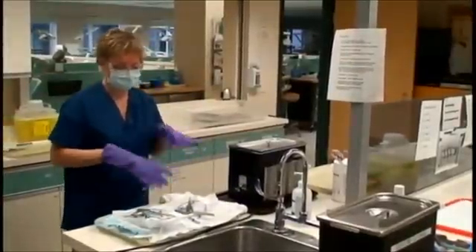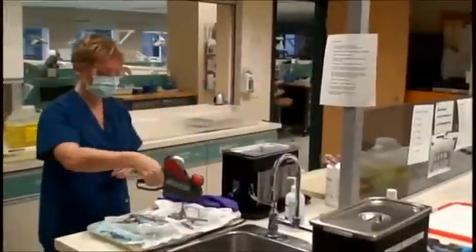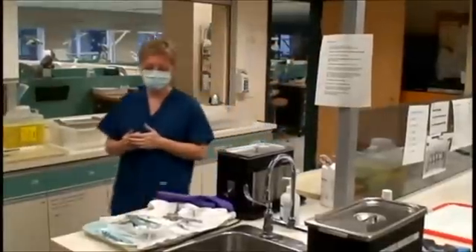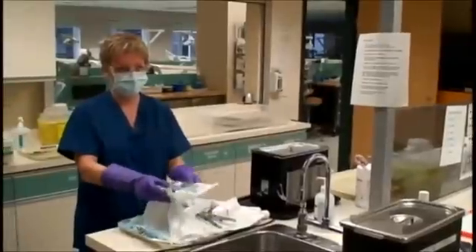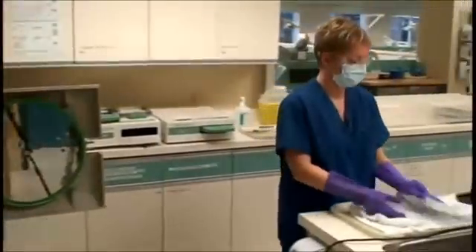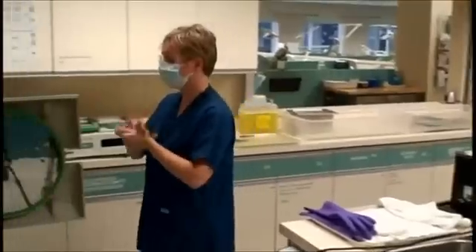Take gloves off and sanitize hands. Using the label maker with clean hands — being careful not to touch the bags, as they are not sterile at this point — apply a label to each bag. Labels must include the date, load number, and sterilizer number. Put gloves back on. Sterilization bags are contaminated, so place them in the tutnauer with the paper side up. Do not overload. Take off gloves, sanitize, and close the door.